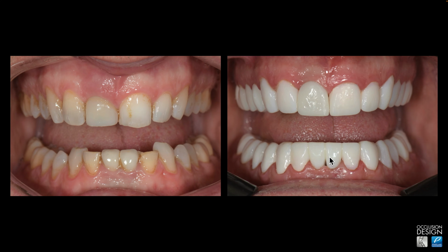And here we had those Nobel 1 implants. So I had to take off the existing metal ceramic crowns. I had to pack cord around them and take basically a crown and bridge impression. And then I had to make the provisionals right on those abutments. So here, we've got a little bit of space in the papilla. I've left it so that this will rebound into there. Tried to keep the contour really available for the tissue to rebound around it.